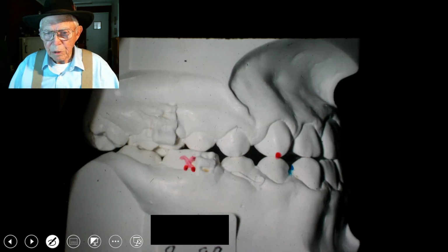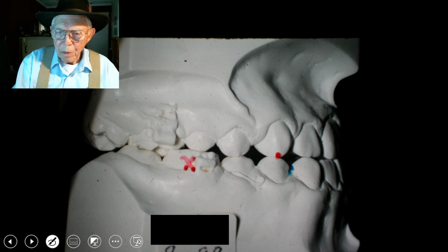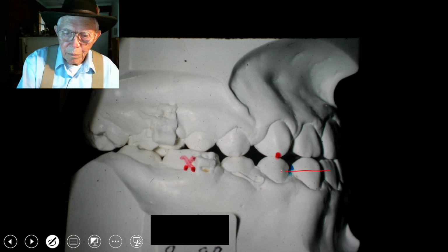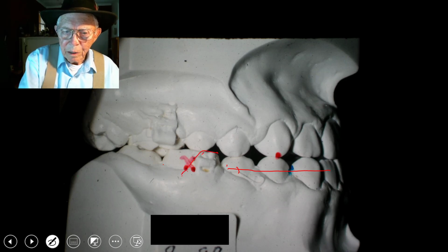Okay, here is the tooth where we come in, and we're going to actually bring these teeth back, you see, and we have a big gap in here. So we're going to try to bring this tooth all the way back, something like go up in here.